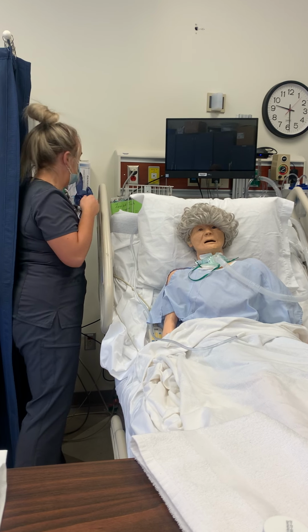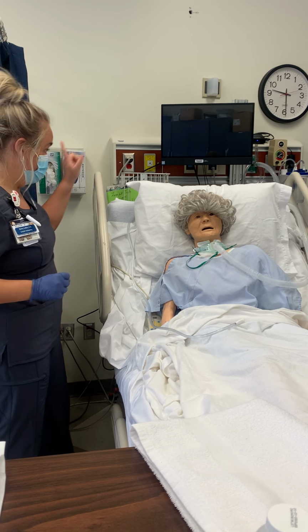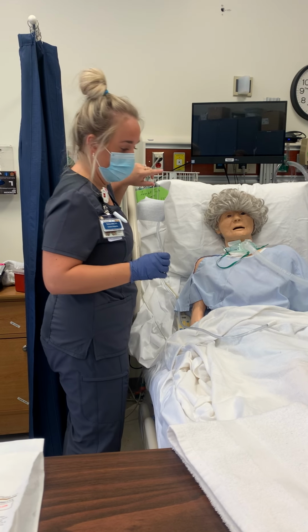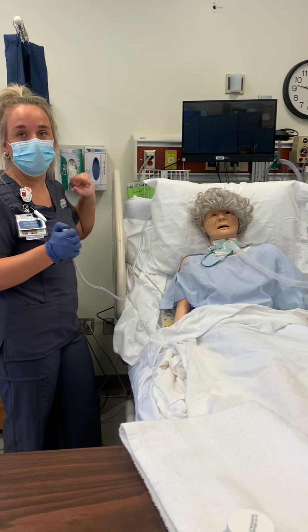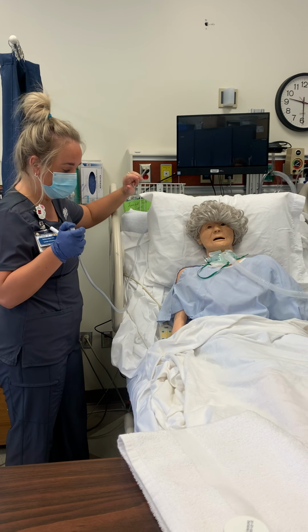Okay. Just a clean glove. I'd want to turn my oxygen up to hyperoxygenate her, and then I'd want to go ahead and turn my suction on, continuous, and then I would just check it, making sure that it's stopping between 80 and 120. Awesome.